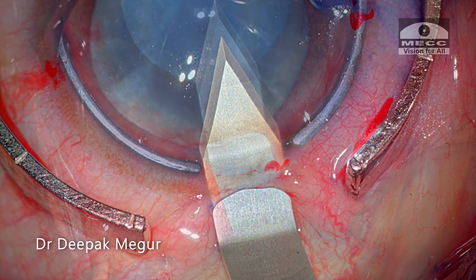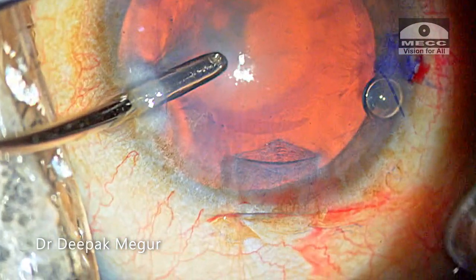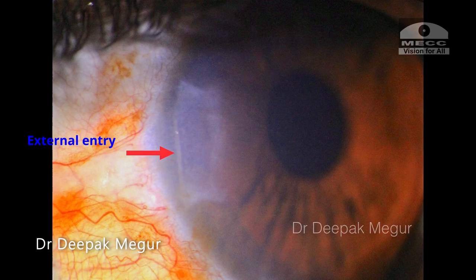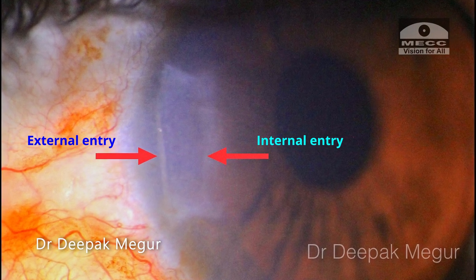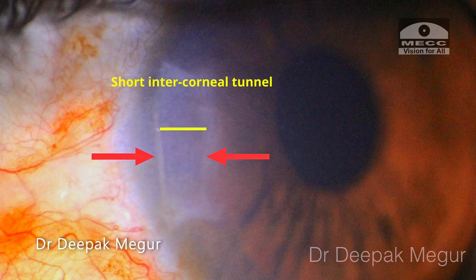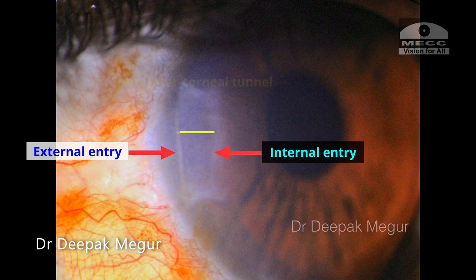Having discussed the features of the perfect incision in previous episodes, let me demonstrate how a poor incision would look. This is the external entry and this is the internal entry. The external incision is far away from the limbus in the clear cornea, away from the vascular limbus — hence, healing is going to be delayed. The intercorneal tunnel is very short, in fact hardly any. So this wound would not be the most safe nor the most stable one.